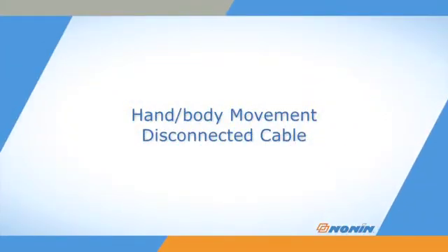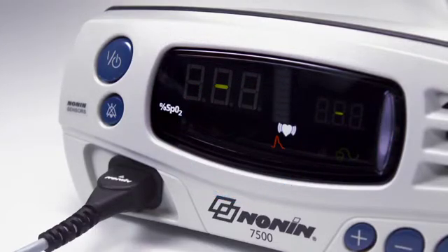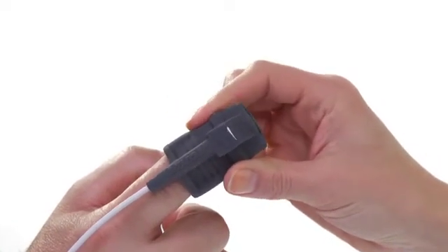Signal loss from the sensor is possible with hand or body movement or disconnection of the cable. A sensor icon will appear on the screen and the oximeter will alarm if this occurs. Signal can also be reduced by body position or cold conditions, which may reduce blood flow. Check and correct the position of the sensor if it has moved.